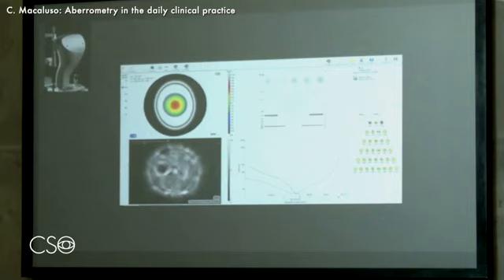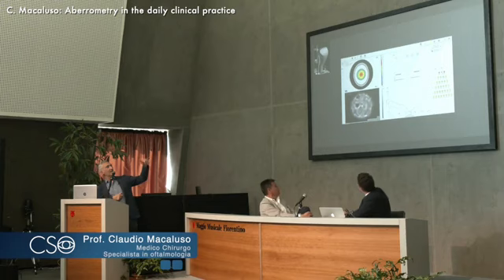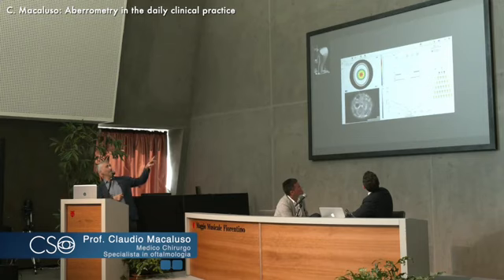It's a circle. In fact, you see on the right there is a Zernike pyramid that splits the aberrations into all the components. And you see I cancelled the cylindrical aberrations, so only the sphere is left, which is pretty bad. In fact, the optotype is barely visible.